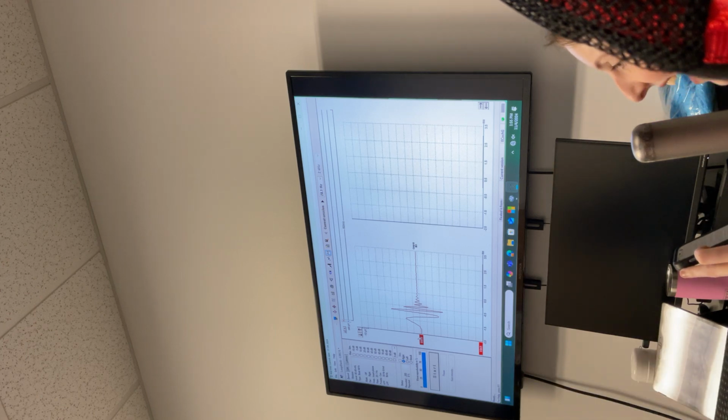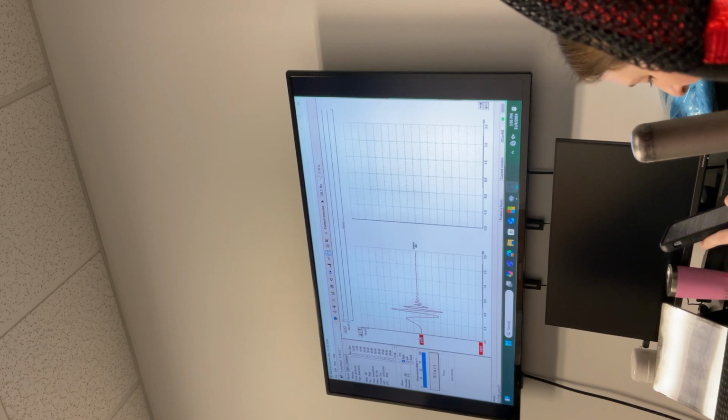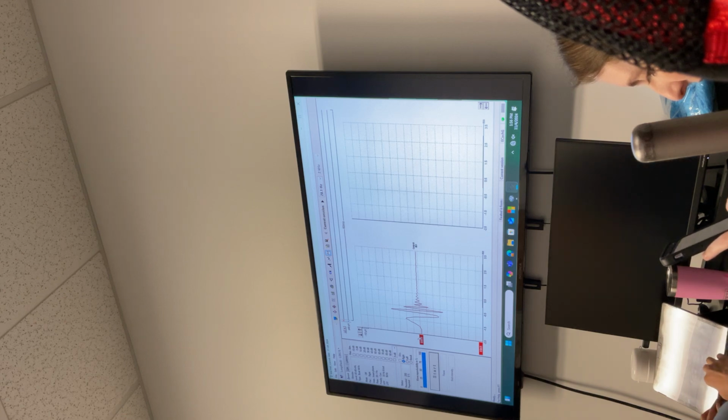Yes, because if you're only used to the tone burst at 500 Hz, you're looking at 12, 13, 14 milliseconds, but here it's all matched with the click, so it's going to be all early. And it's not actually that early physiologically. This is all just engineered. It's all artificial on the 0 point.